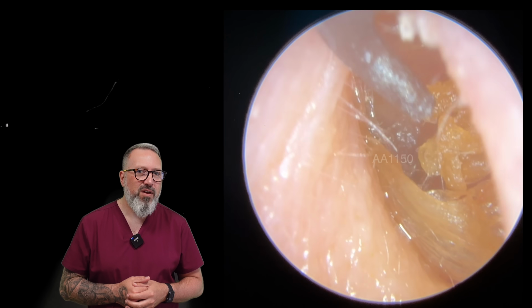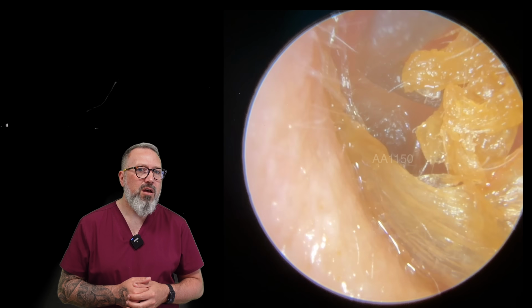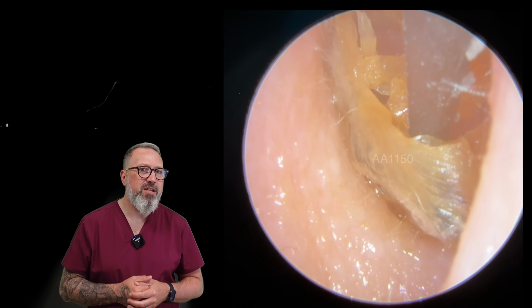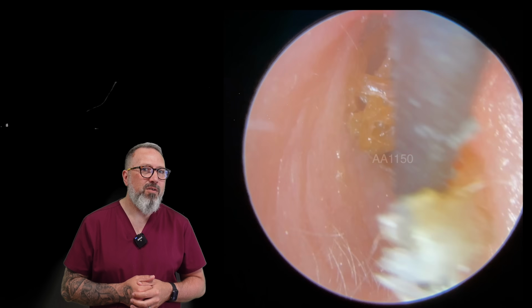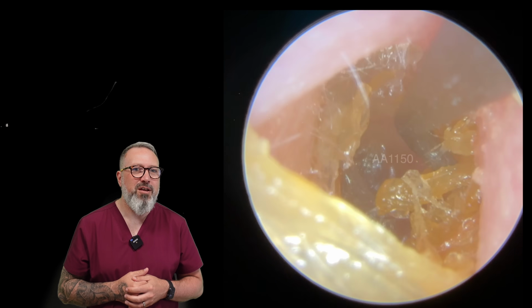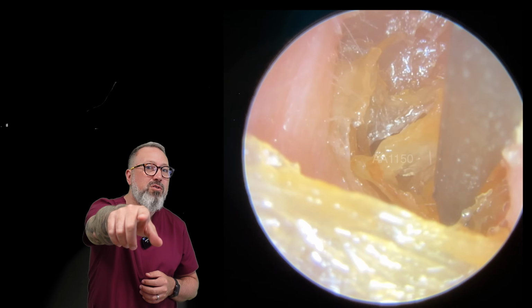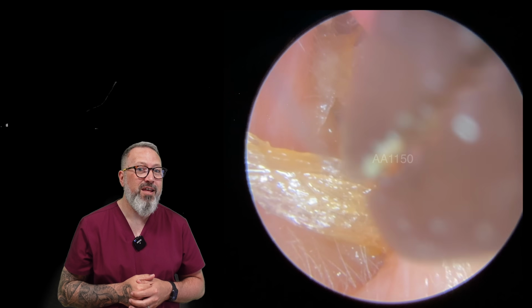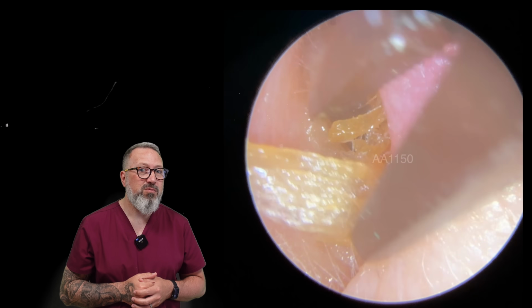So I'm thinking, okay, if I get over here now with a right hook, I might just be able to hook that bottom section, if I can just get enough of it, if it stays together. But unfortunately for me, as I pulled it, it just unraveled on the one side quicker than it did on the other. And look at how all that skin is peeling away from the canal wall really effectively there. So we're going to go in now, let's grab this with a forceps.